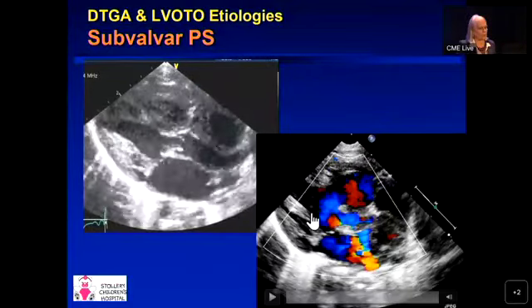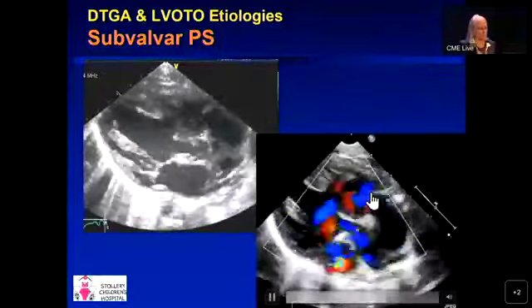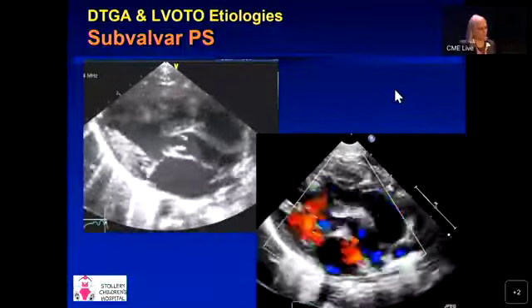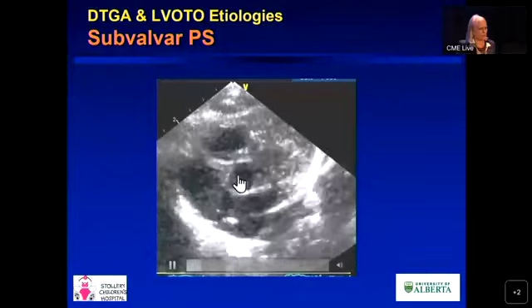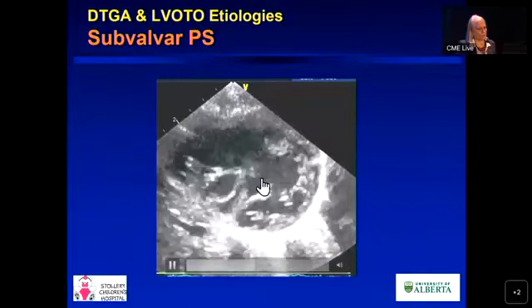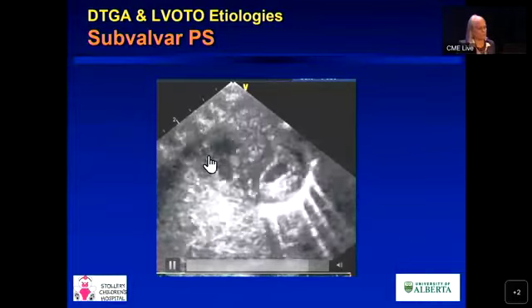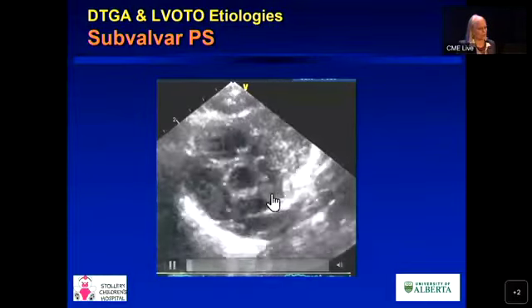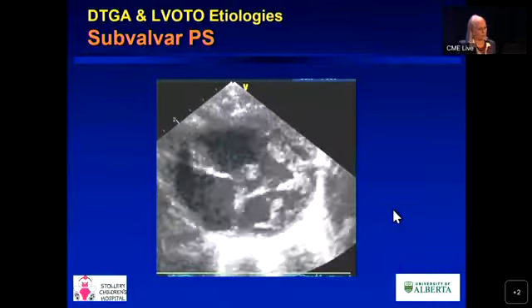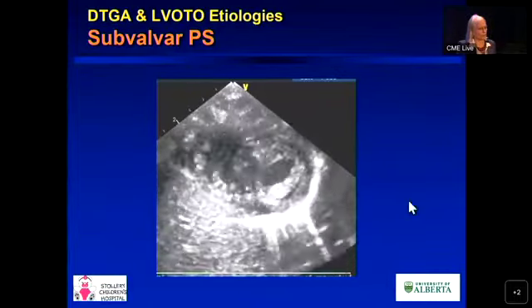And so with this baby, they weren't, of course, wanting to do a Nikaido as a newborn. They prefer doing that at several months of age. But there's a fair amount of sub-PS, and then this ventricular septal defect was a bear. This is just showing you that it was a bicuspid pulmonary valve, not terribly small. But what you're seeing as you go down is this muscle bar that was very bizarre. It went from the left ventricle into the right ventricle, didn't have significant AV valve attachments on it, but sort of separated that large VSD into kind of two orifices. That was a little bit tricky, and that VSD went all the way up anterior and was quite large.